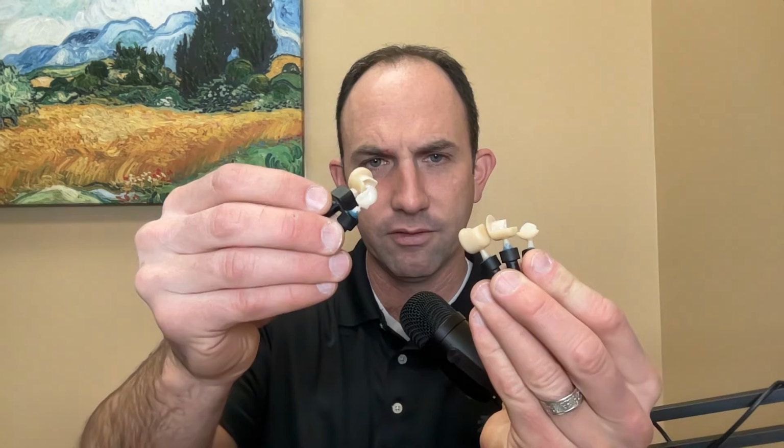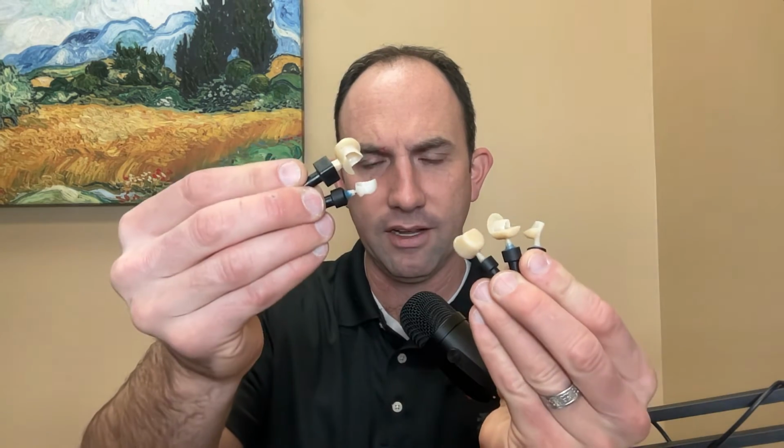So I have several little ingots here, little blocks that for whatever reason the machine stopped in the middle of. And honestly, this is all of them. I have 5 of them here. 5 of them in 4 months. These are the only error blocks that we've had. And we're doing 4 of these a day on average. Maybe 5, maybe 6, I don't know. It just depends. So it's interesting to note how the machine manufactures it.